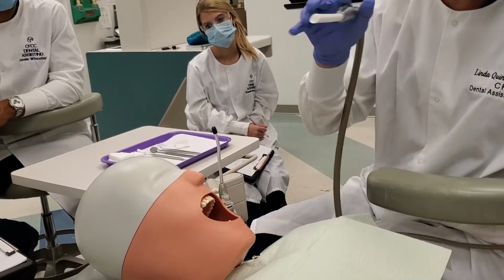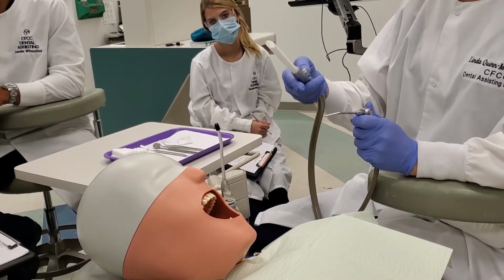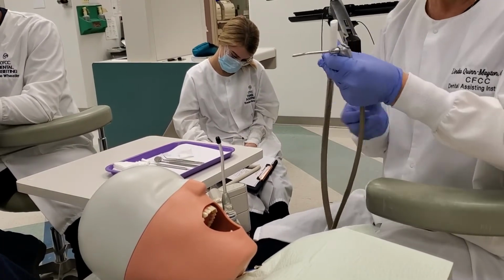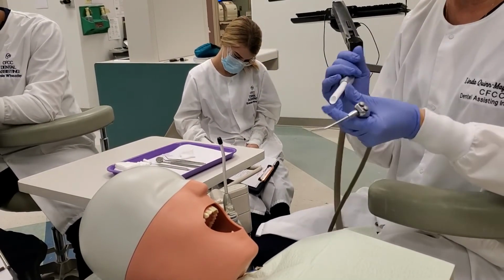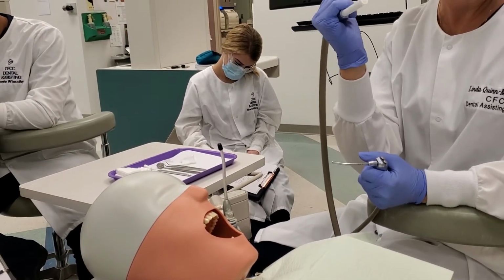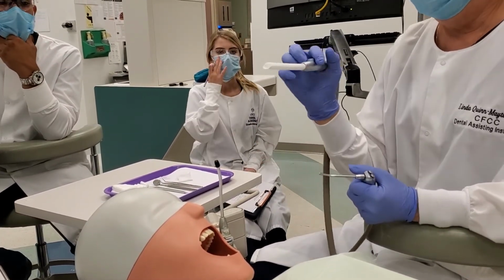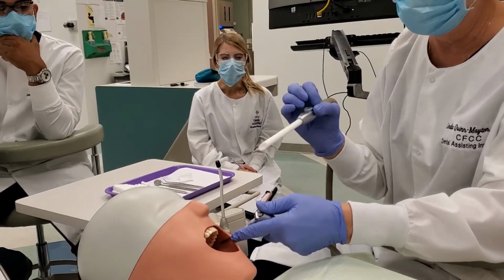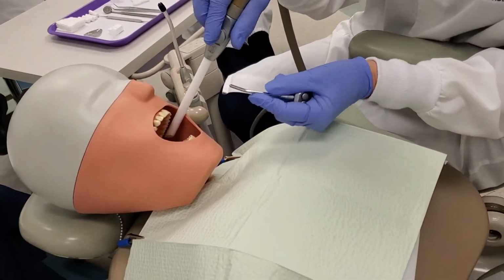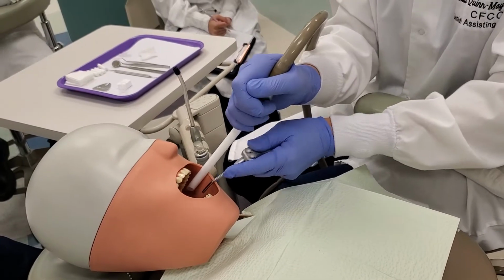So pick up the HVE in your right hand, turn it on to use it to retract the cheek on the patient's left side. Again, you don't want to turn this on until you have this in the patient's mouth. Because you're using it for retraction, you're going to have it in your palm thumb grasp. Anytime that you're using the HVE for retraction, this is it. So you're going to come on in, see how that twists around like that? You're going to turn it on, and you're retracting that cheek.